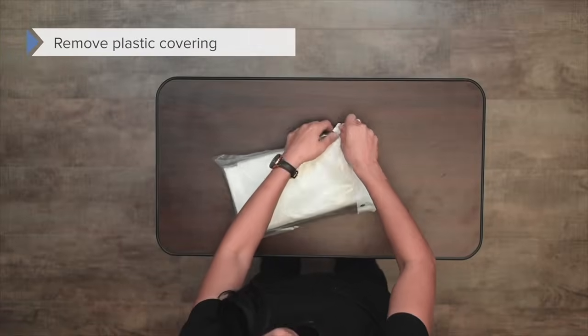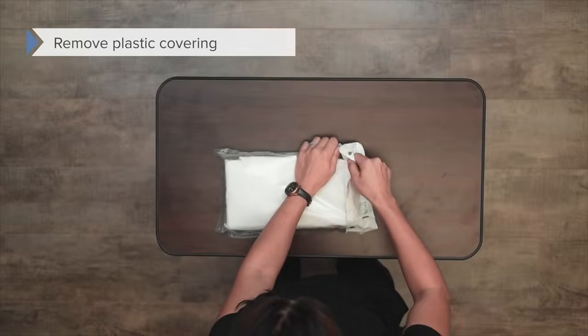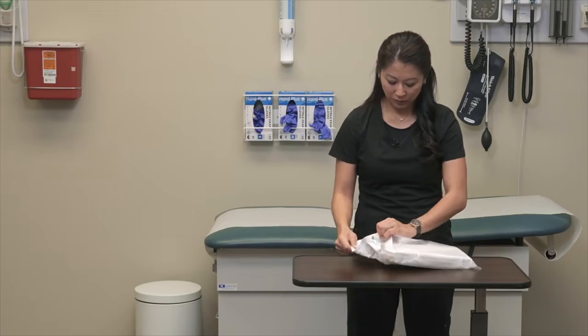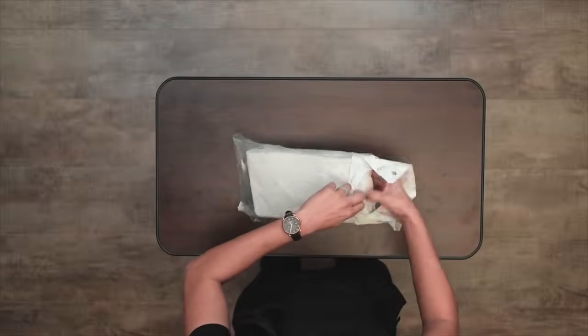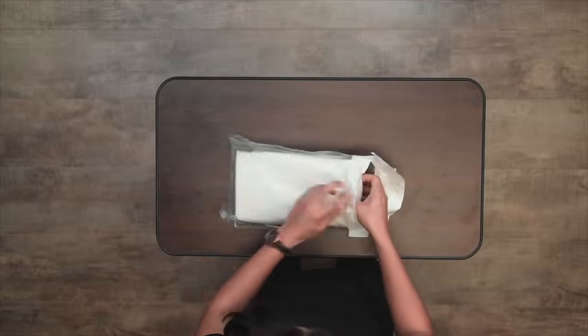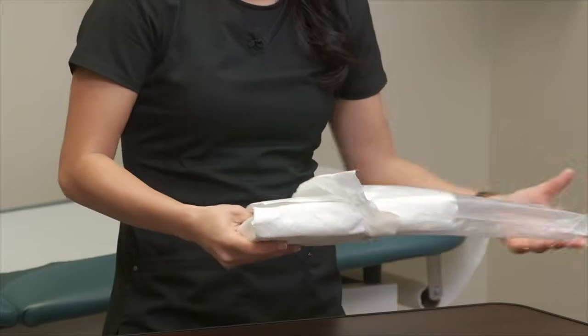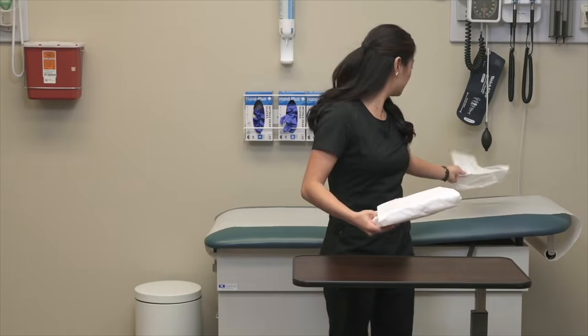We're going to have to take off this intact tape here and peel this open. We're going to remove this package from the plastic covering and open this up. And we can get this out of our way.